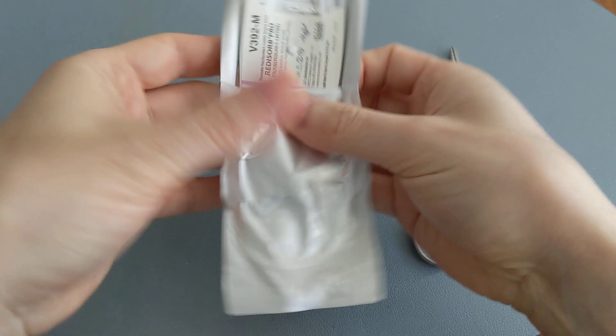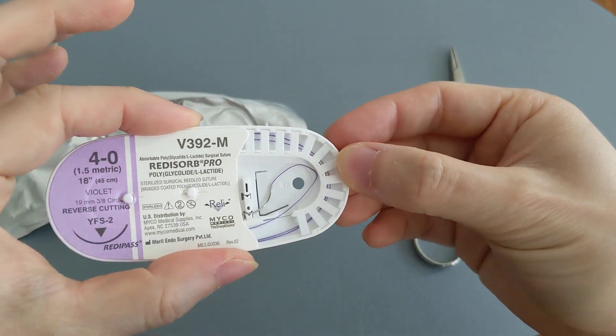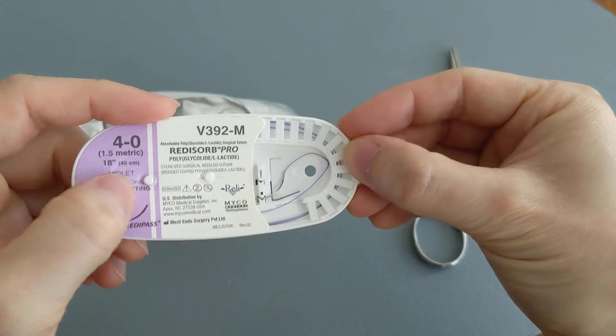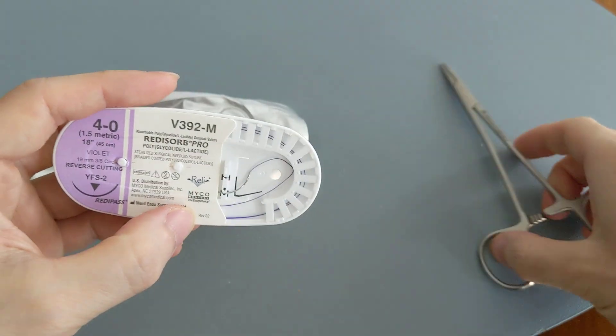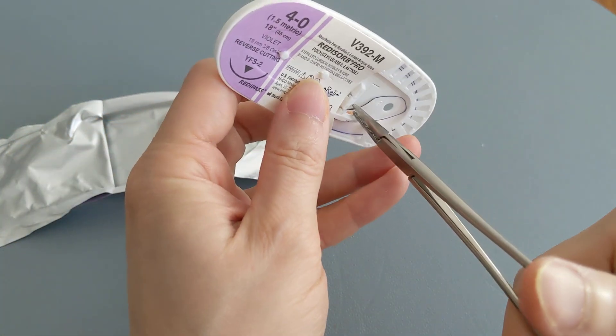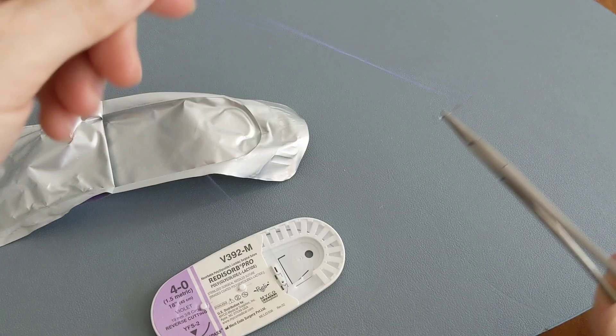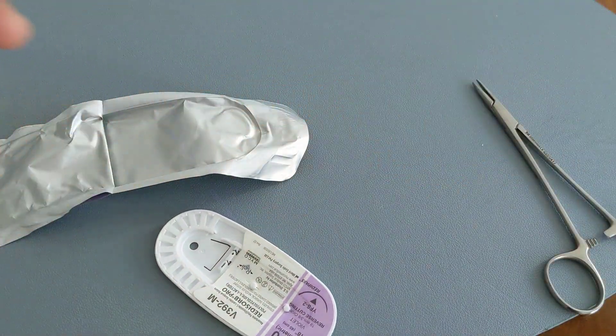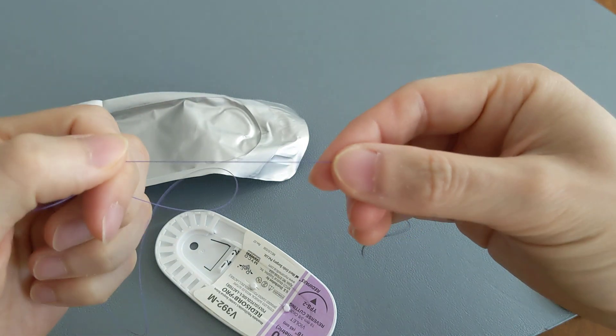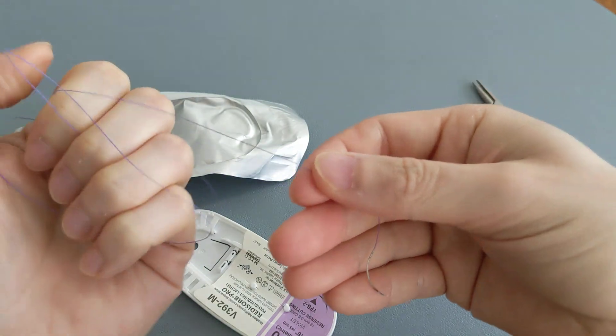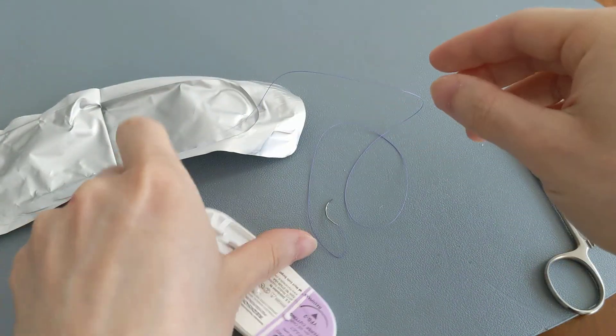So here are some stitches and these are very purple. It's actually labeled as violet in color, but let me take it out so you can see it a little bit better. It's definitely purple.